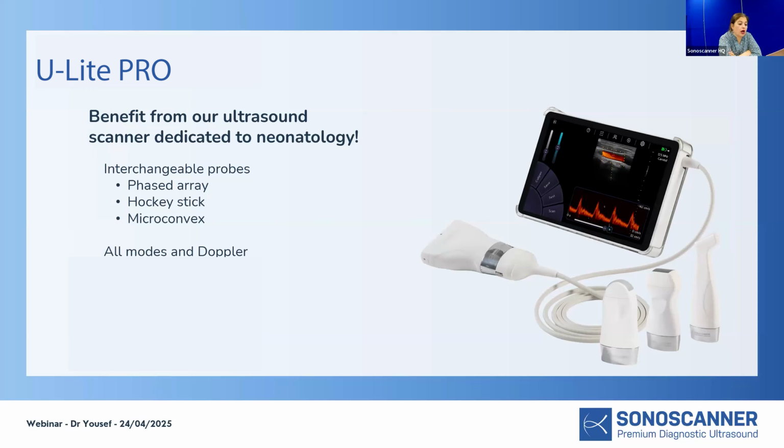What about cutoff scores for switching non-invasive ventilation back to more mechanical ventilation? I would really say that depends on much more than the score, because let's take my setting. We hardly have any ventilated babies, because the babies who do need surfactant are extubated. Many centers use the LISA technique, we use INSURE. So we have very few babies on mechanical ventilation for a long time. Our mean time on ventilation is quite low as compared to other settings.